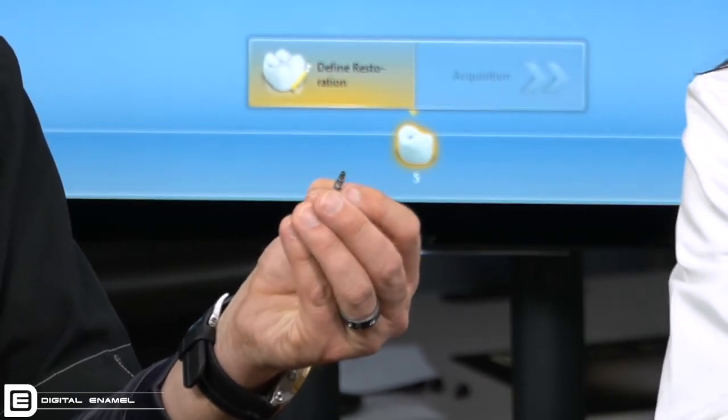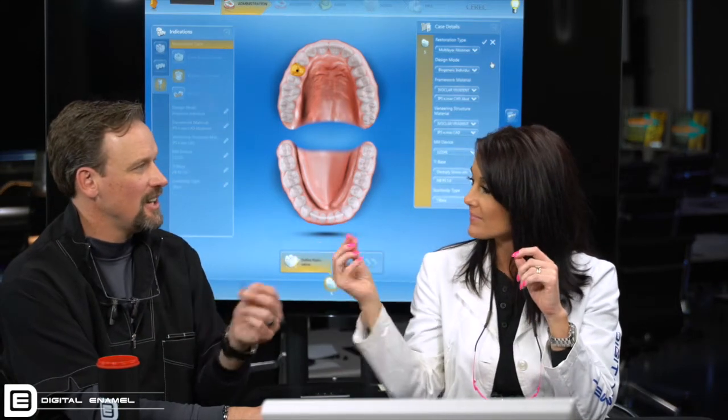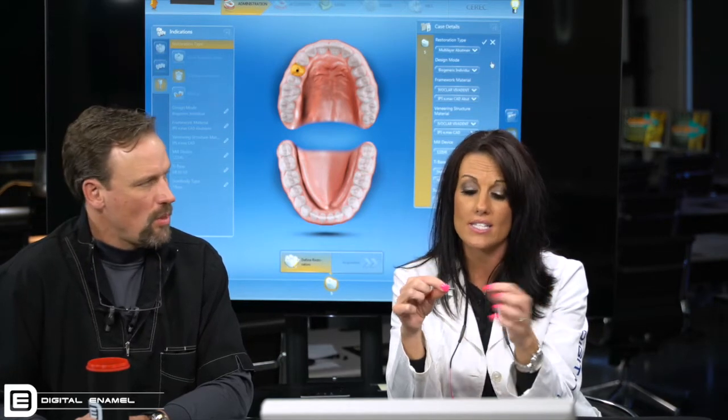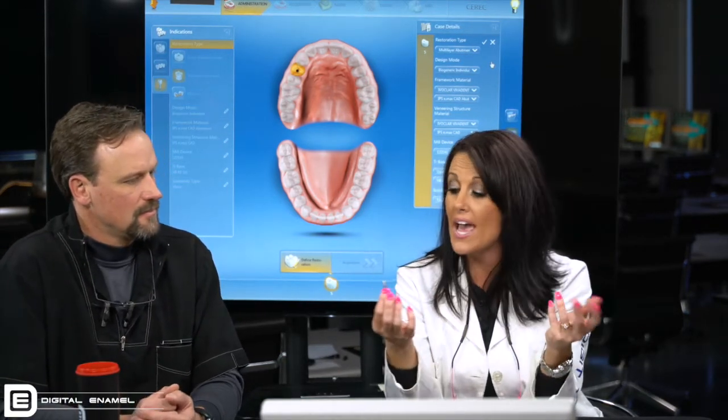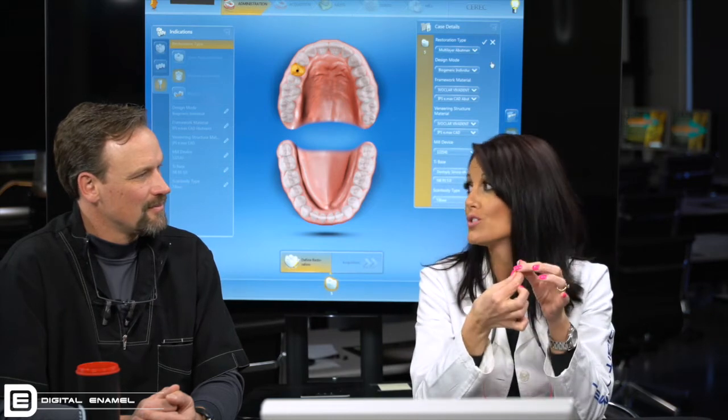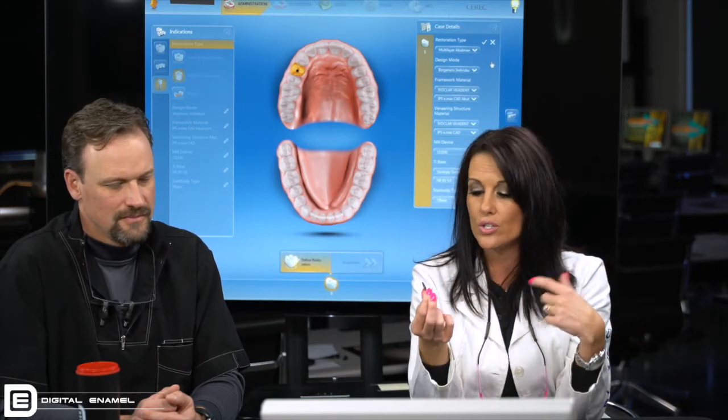If you have the analog, you can see the scan post screwed into the analog. That does a couple of things: one, you always know what size it is — once it comes out of the sterilizer without the size marking, you can try it into the analog if you get confused. If you've had two implant patients with different sizes and everything comes out together, you never have to worry about which size is which. It also keeps everything together so you don't lose the screw, because when things are in these boxes, screws get lost and then you're ordering new ones. So we always keep an analog — two scan posts, two analogs.